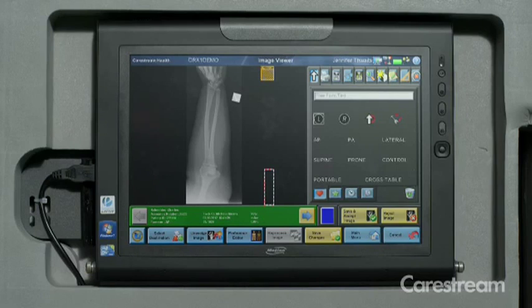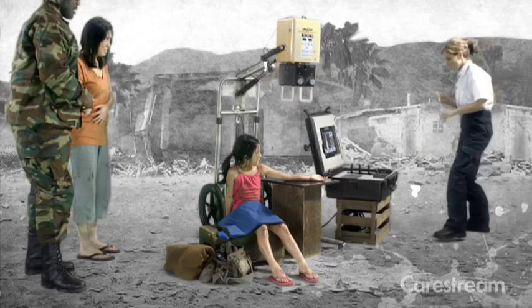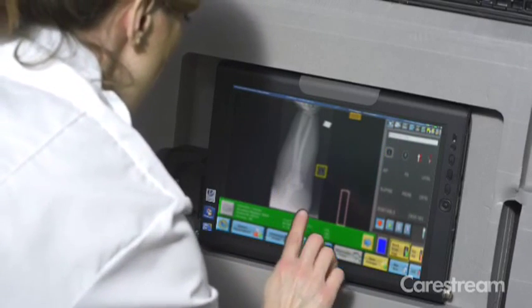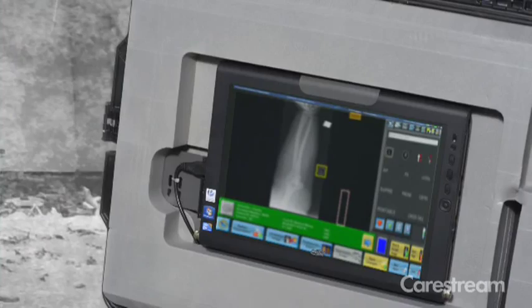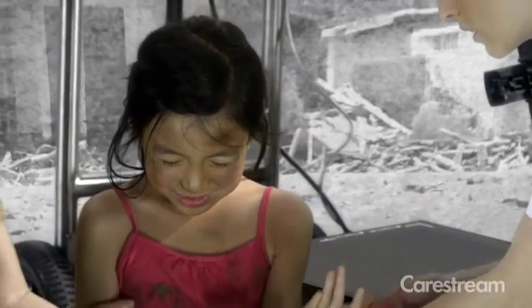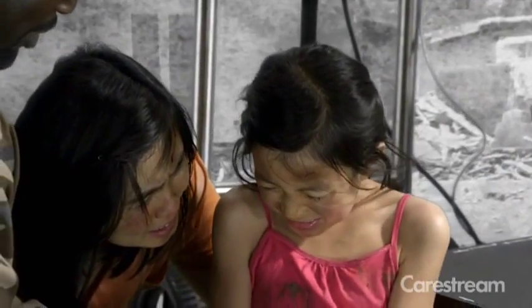These images are available immediately after exposure. Just zoom in and check for positioning, add markers, then simply accept the image and it's stored. No waiting and wondering if the critical view was captured. We know seconds matter.